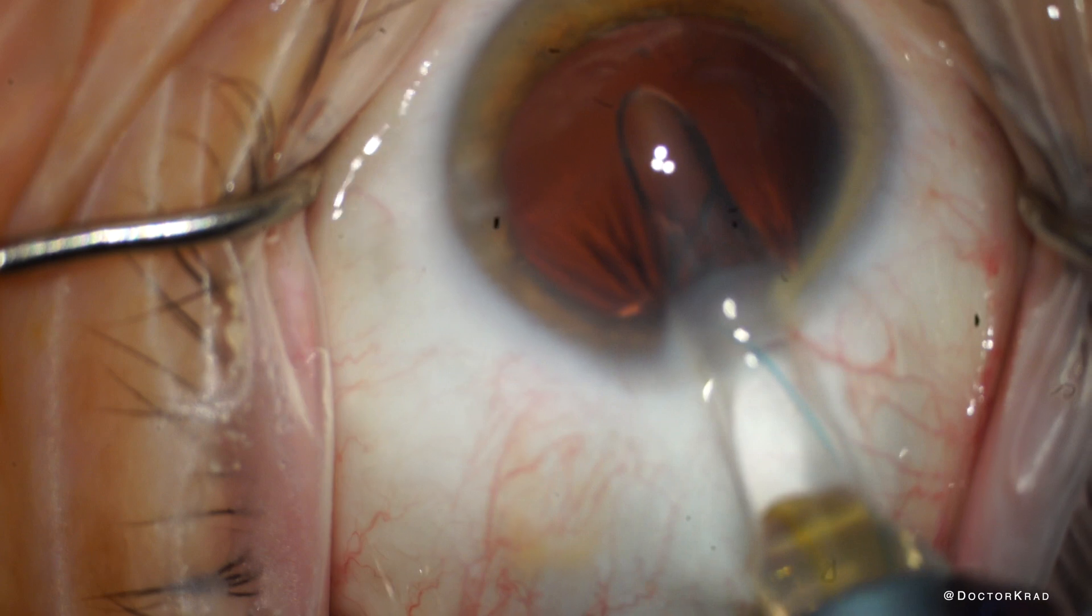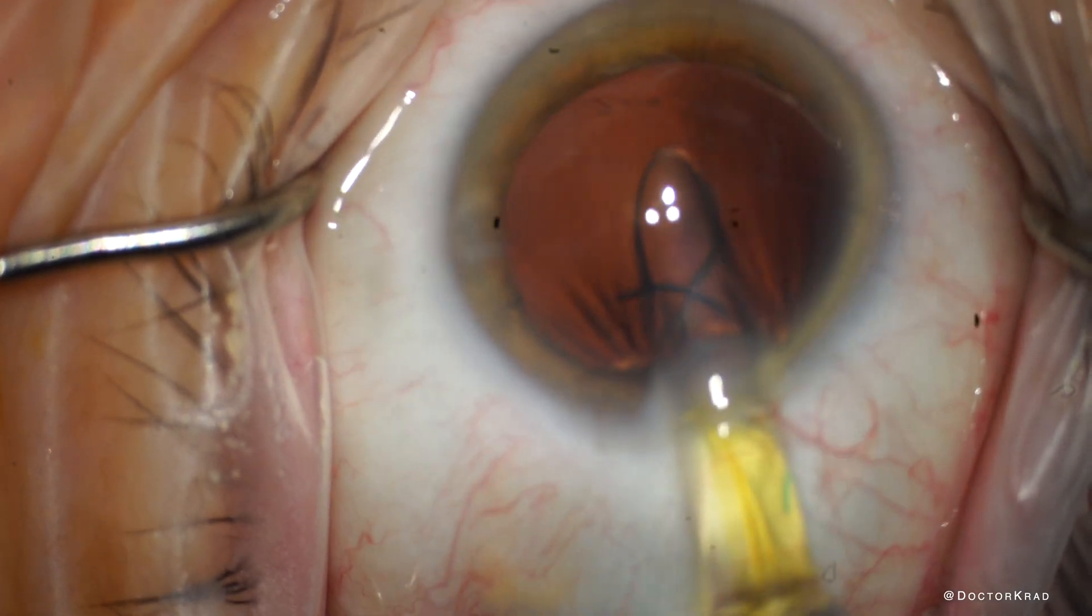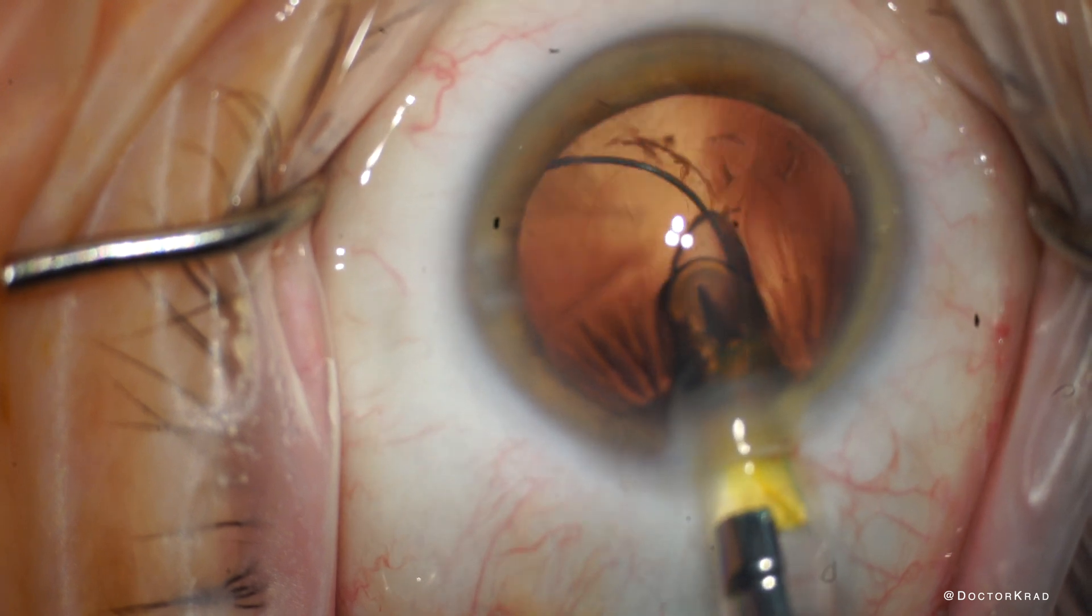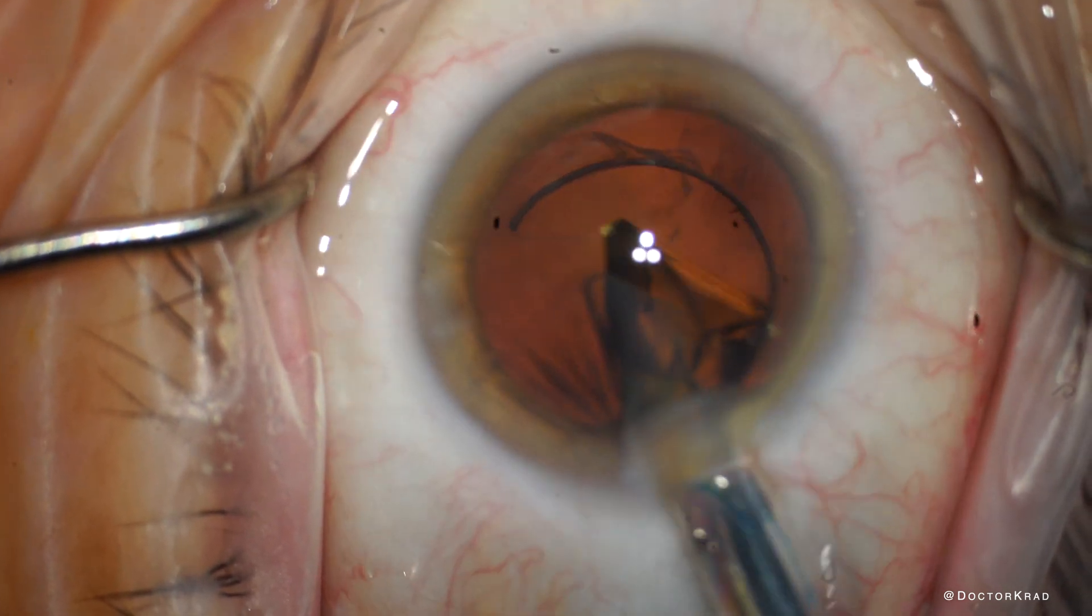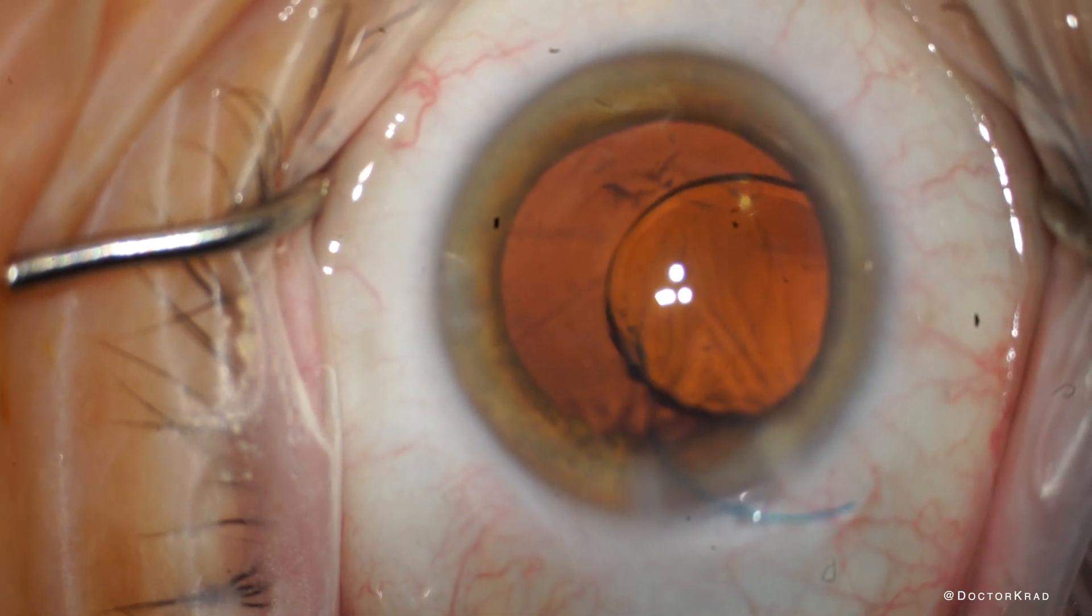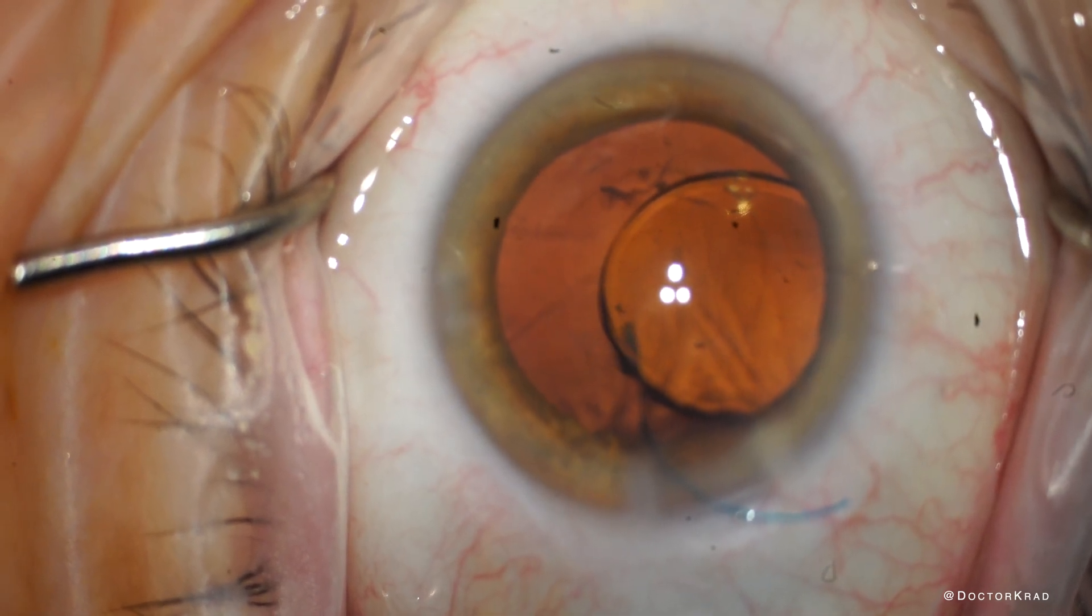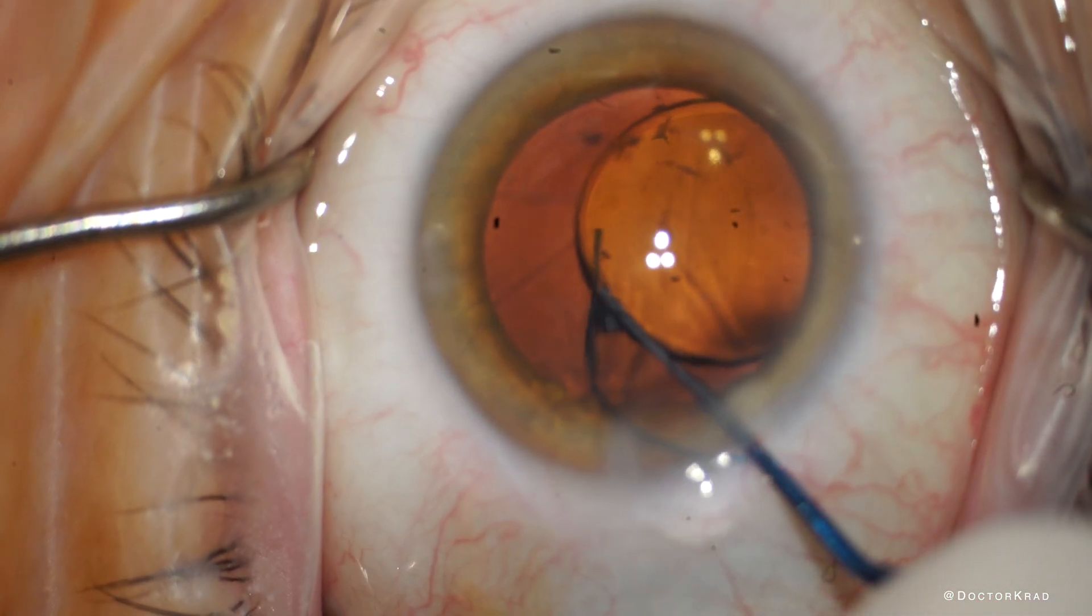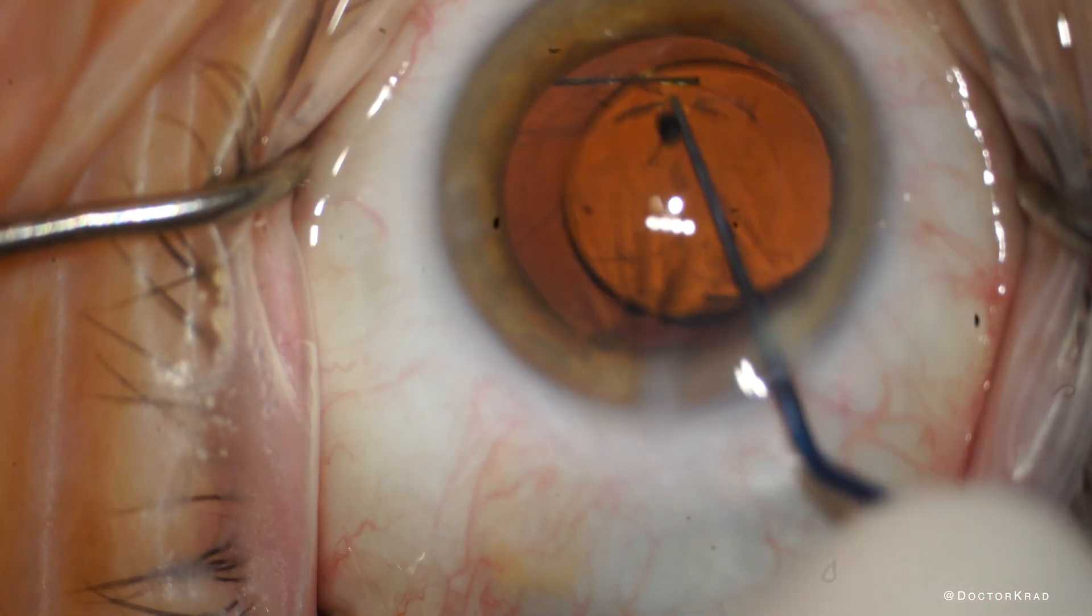And as you advance, rotate the injector clockwise so that the haptic comes out planar. And then you're going to rotate counterclockwise about 180 degrees to deliver the lens. I then remove the injector. I like using a kuglin to dial the lens into the bag. I put the kuglin at the lens haptic junction and we just rotate it in.